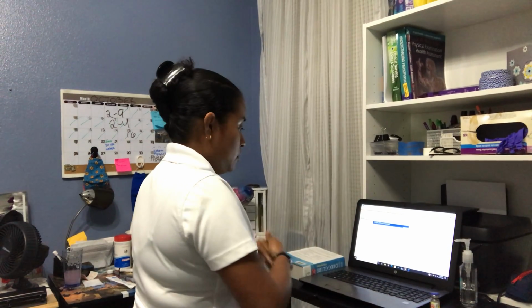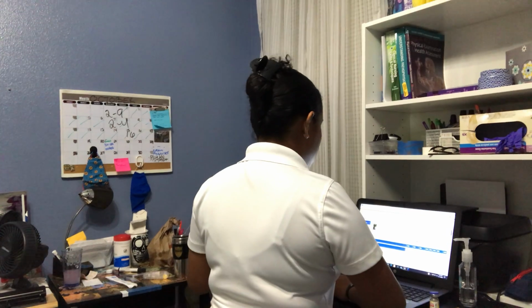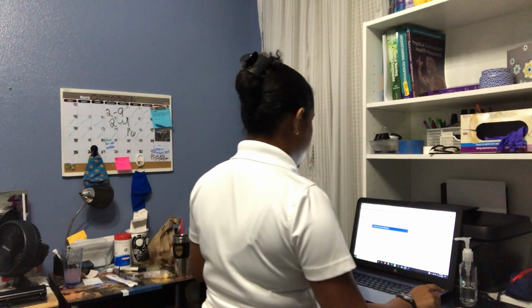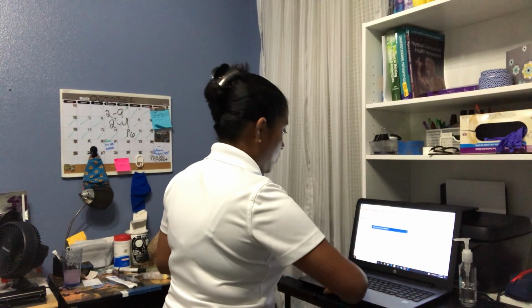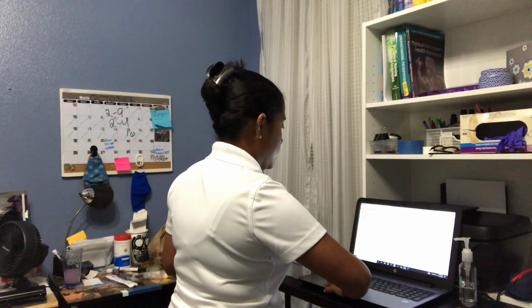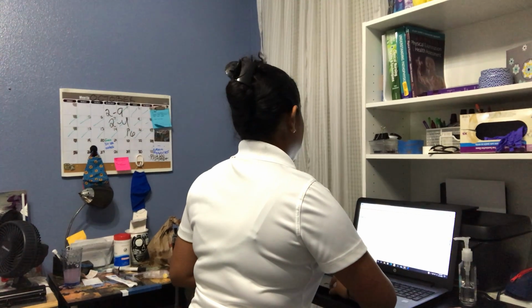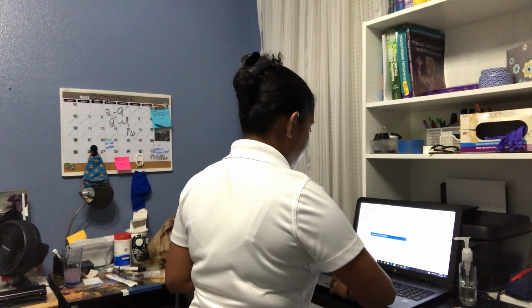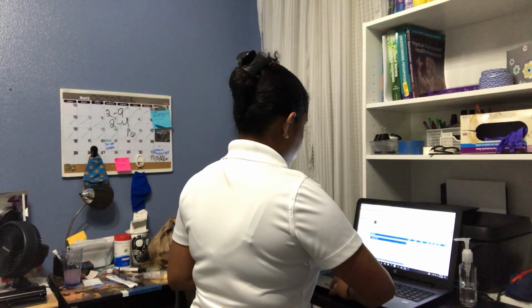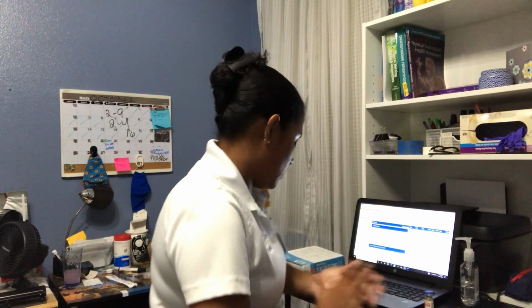Next, I'm going to do, again, the second MAR check. Like I said, the patient is Oscar Simpson. The medication is a medium-dose insulin lispro. The dose is 4 units before bedtime because it's 1900 right now. The route is subcutaneous at the anterior aspect of the thigh, and it is scheduled for right now. And we calculated the medication. Okay, so next I'm going to clean my hands and we're going to get started with preparation of the medication.